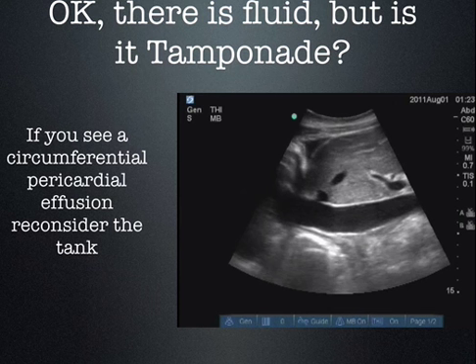If they are stable, if you have a person in your center who can come in and do the pericardiocentesis, that's what you should do. If you need to get them out, that's what you should do. If they are unstable, you have to drain that patient. And I would use ultrasound guidance to do that. But you have to do it.